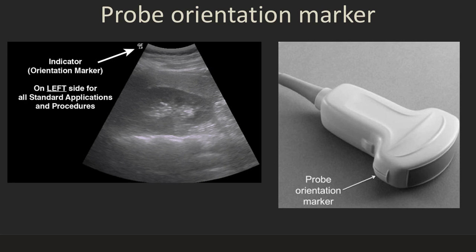Here's an example on this particular probe of the orientation marker. This one has a little horizontal and vertical line. Some of them have vertical lines, some have a little light or a button. That marker will equate to a marker on the screen — the position of this marker will correspond to a specific point on the screen.